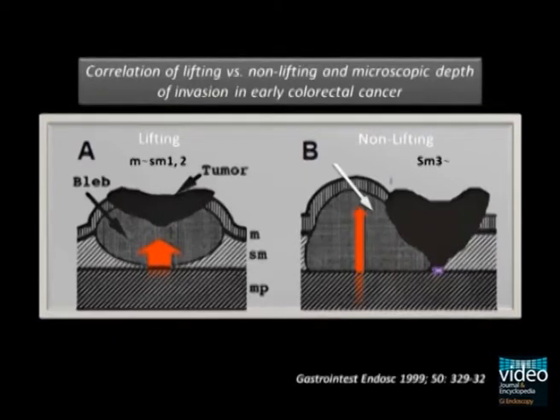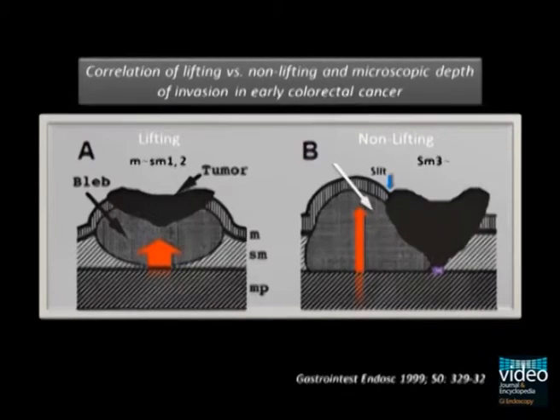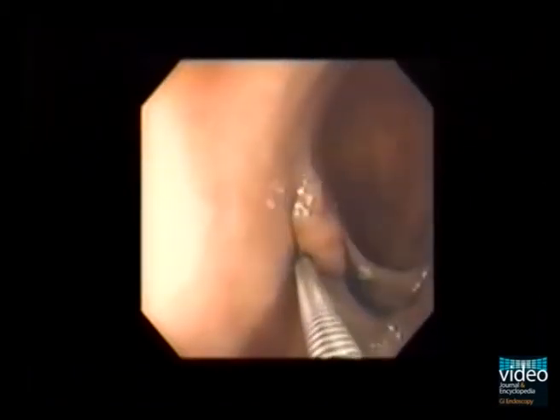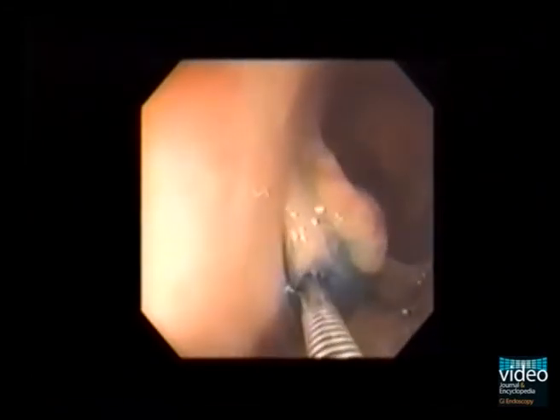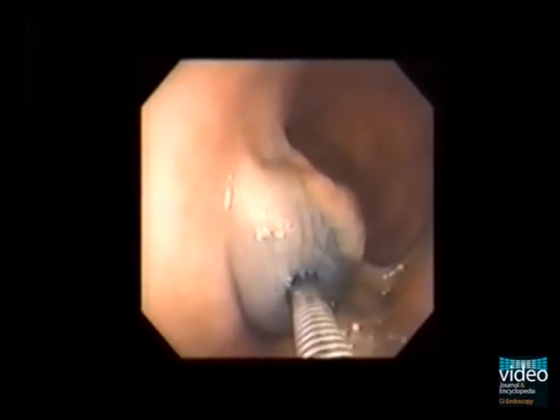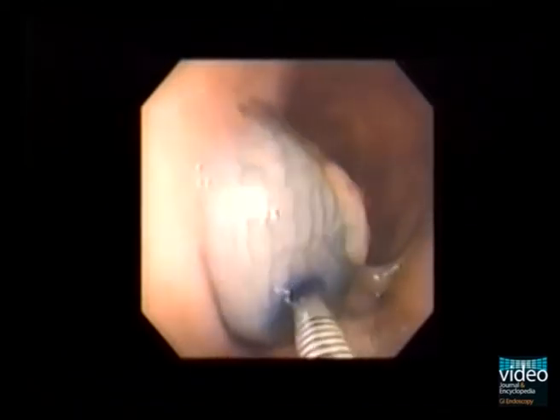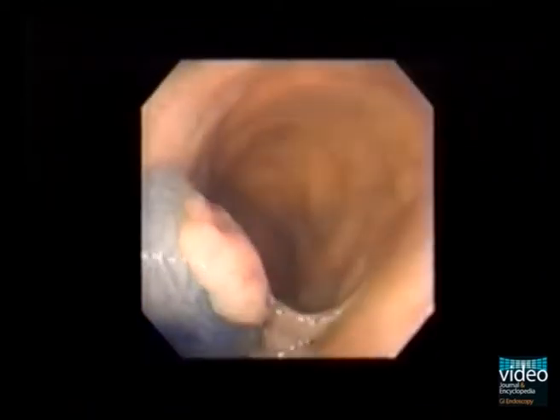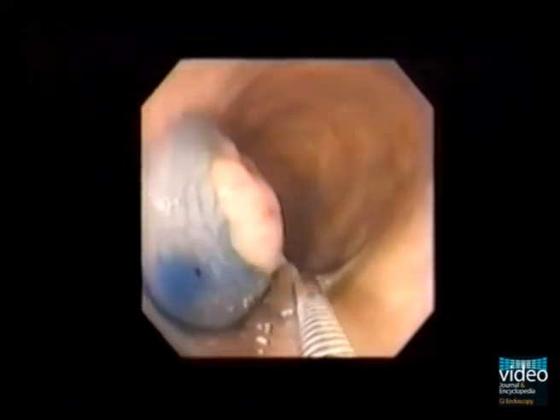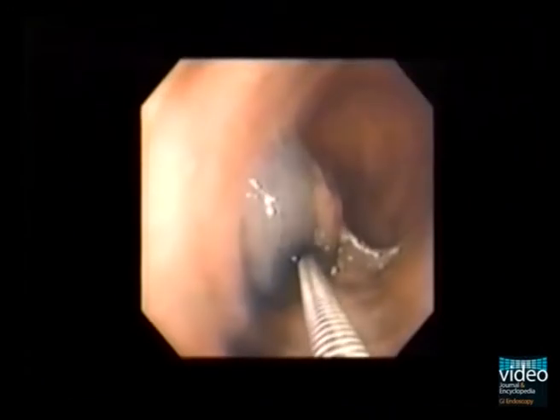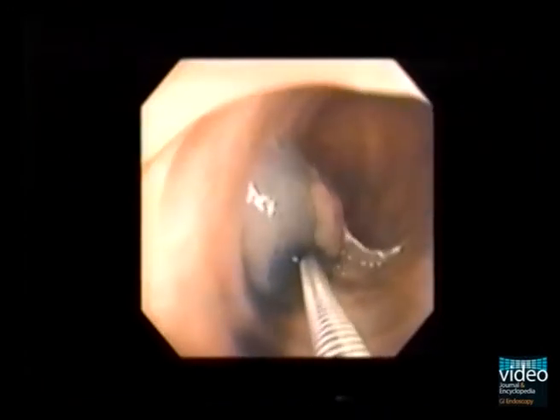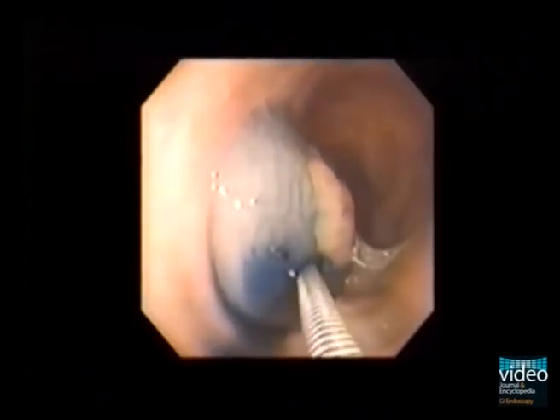The arrow points to a slit that developed between the lesion and the bleb. This is our first case with a colorectal lesion. Inject 3 to 5 milliliters of diluted methylene blue into the submucosa with a 23-gauge needle. Injection should be made into 2 or 3 sites, each approximately 2 millimeters from the edge of the lesion. Always avoid puncturing the lesion. This lesion clearly shows a positive lifting sign, and we can classify this tumour as lifting.